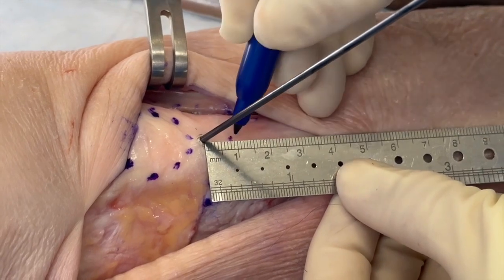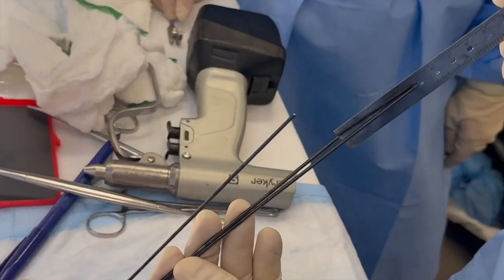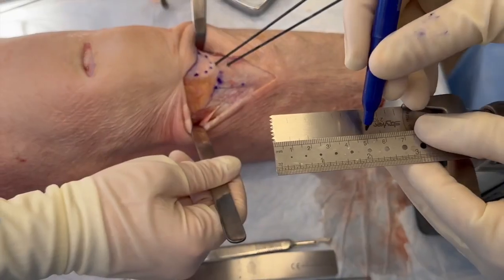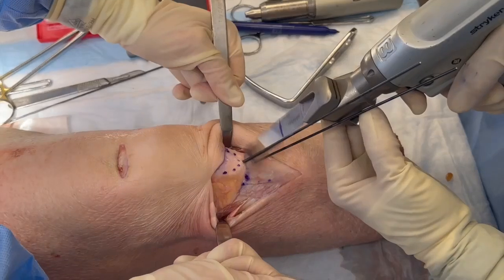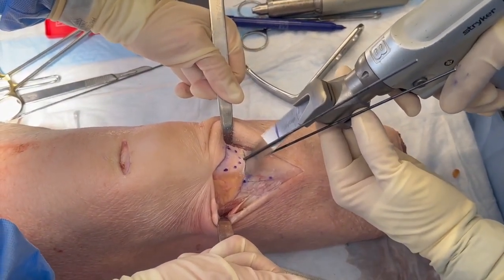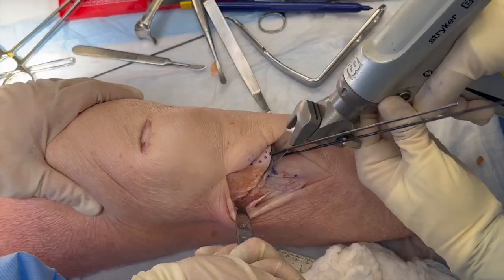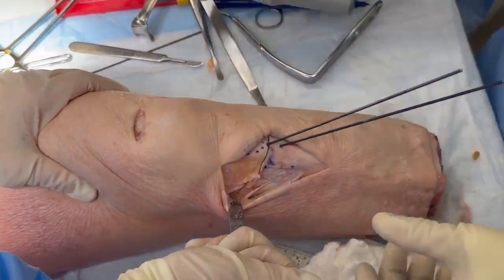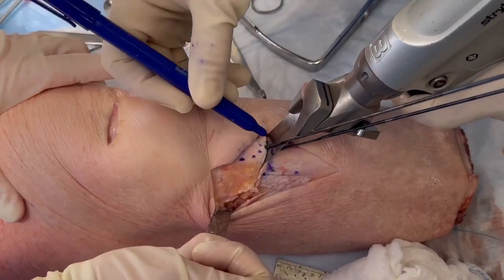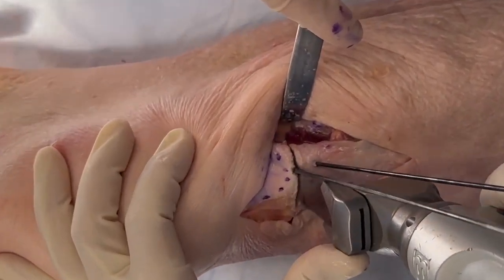In this case, it was about 1 centimeter of a wedge. 5 centimeters is the length of the intraosseous pin placement. And then I mark on a saw blade the length to give me an extra visual reference of how deep to go. You have a retractor under the respective structures. Here again, marking the depth. You want to make sure that you don't penetrate through the posterior cortex to protect the neurovascular bundle.